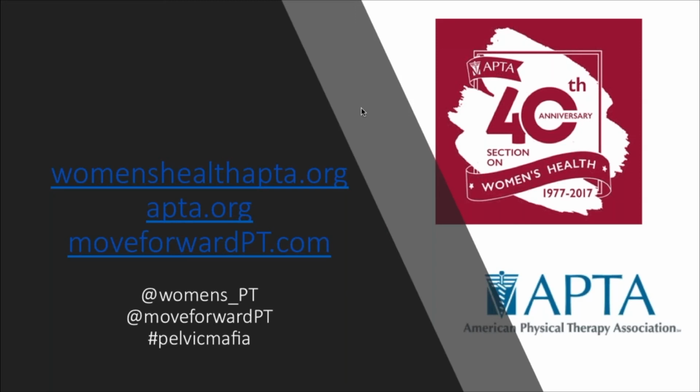From a clear logistics perspective, the primary issue that a lot of PTs may have with a transabdominal versus a transperineal approach might be infection control. Transabdominal is just much easier for infection control as opposed to transperineal, especially if you have a department where you're sharing the unit with multiple other clinicians.